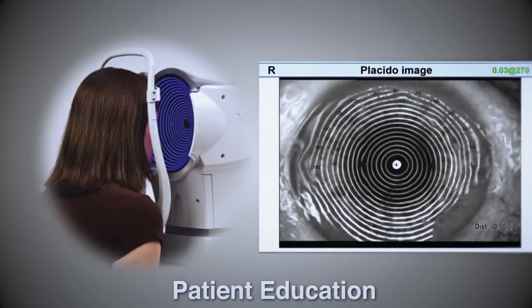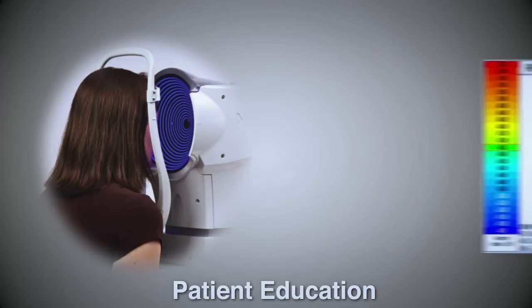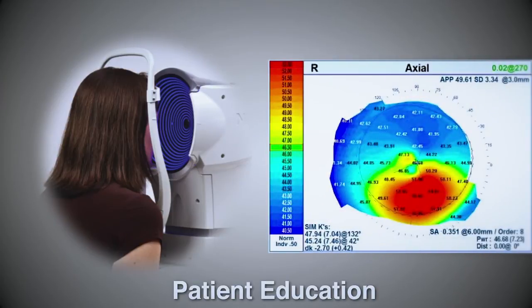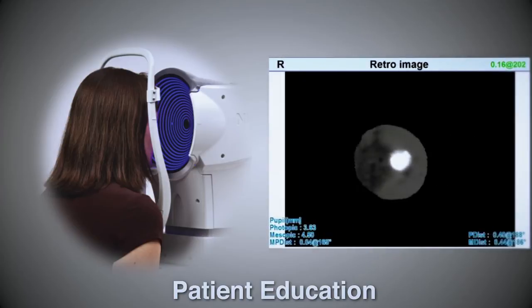Educate your patients by showing them their dry eyes or pterygium with the placido rings, existing keratoconus with topography maps, or current development of cataracts with retroillumination images.